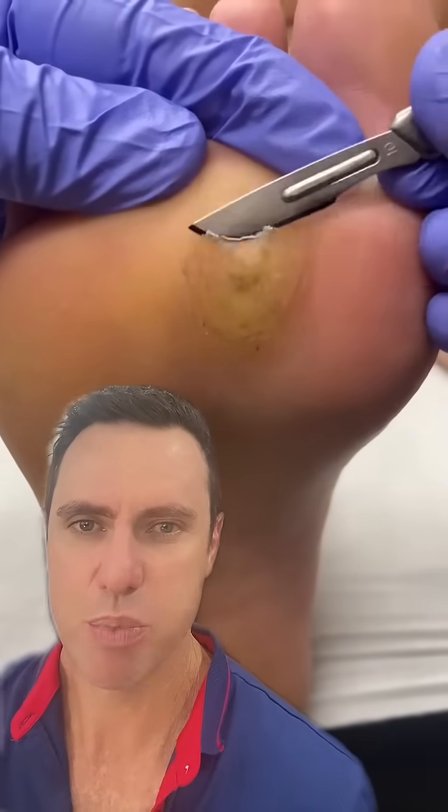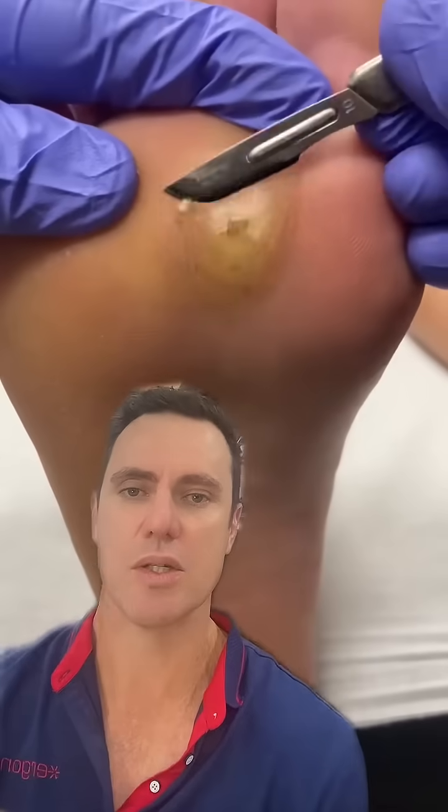What we're looking at here is a plantar callus removal, and you can see that it's got a central corn. The corn is the central hard section of this callus.